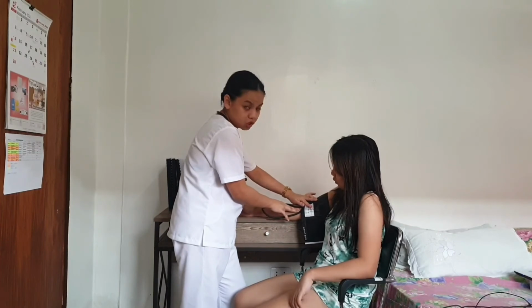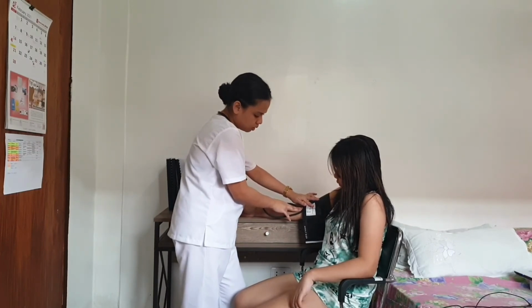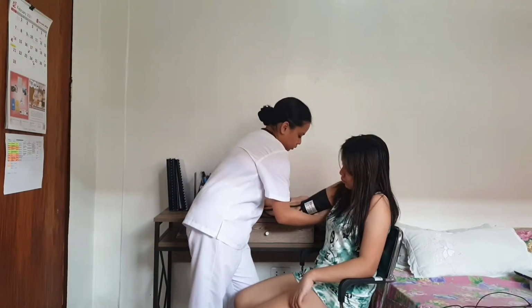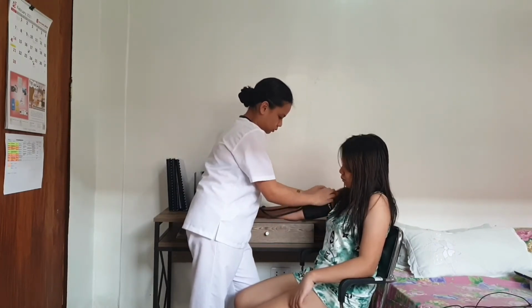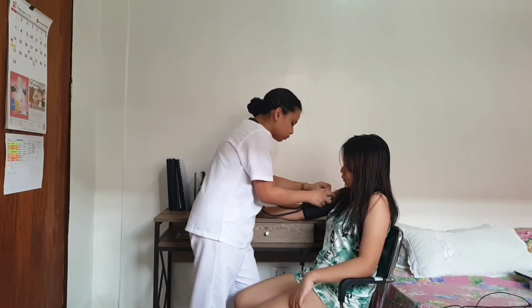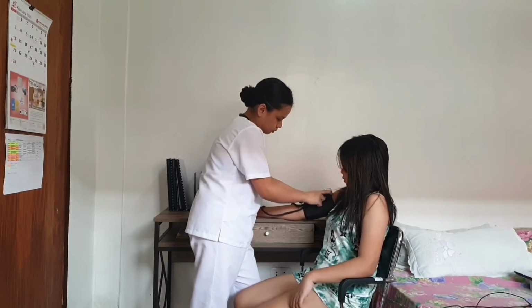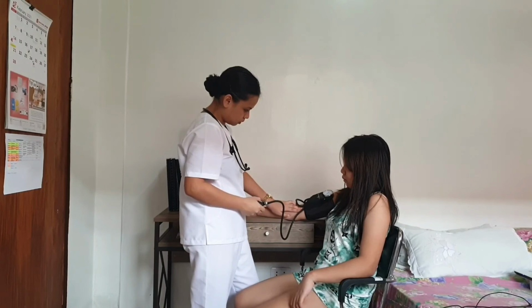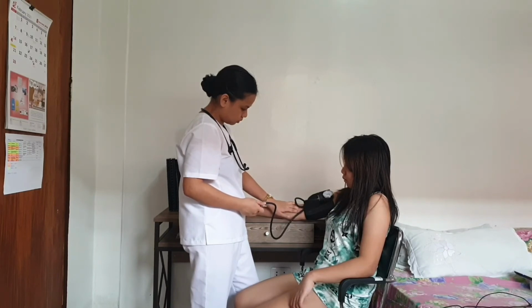So it should be 1 inch above the pulse, and the pulse should be between the two tubes. So I felt her pulse at the systolic of 70.